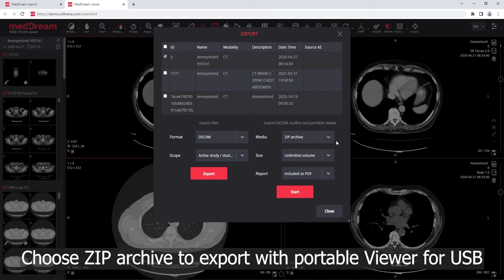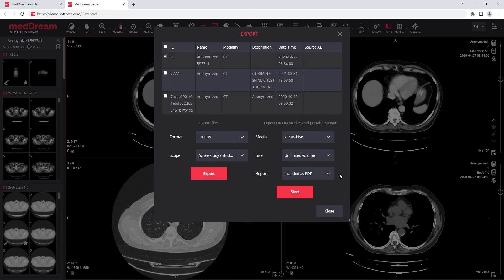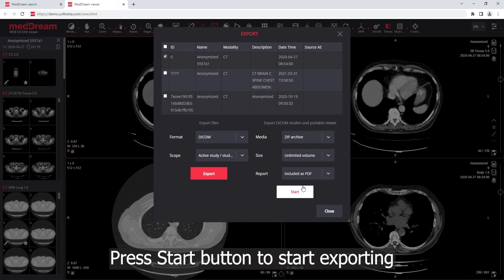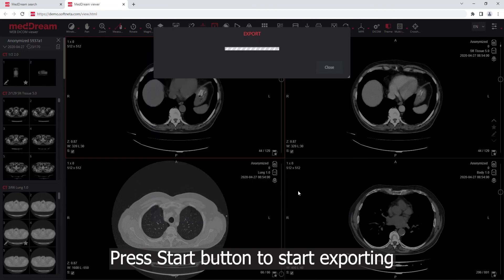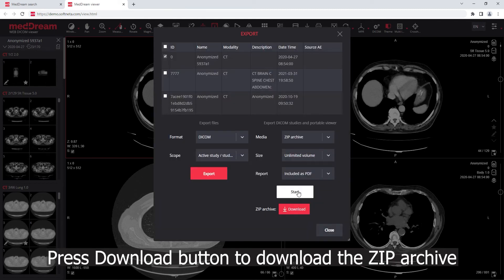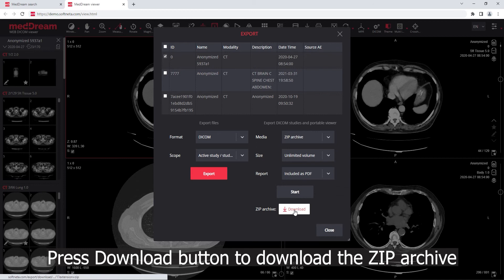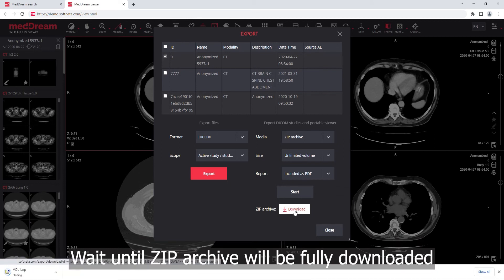Choose the ZIP archive option to export with a portable viewer for USB sticks. Choose the Include as PDF option to export the study with created reports. Press the Start button to begin exporting. Press the Download button to download the ZIP archive and wait until it is fully downloaded.